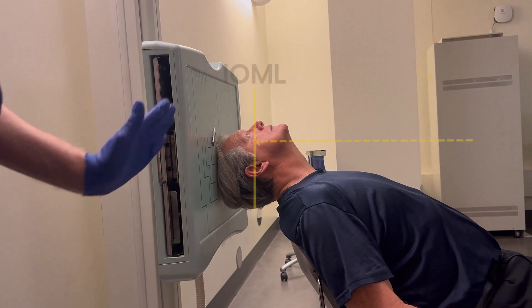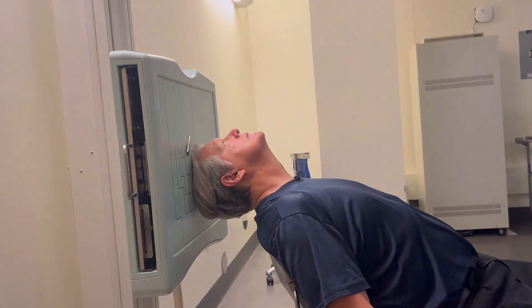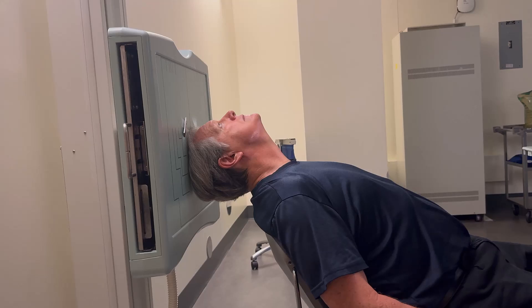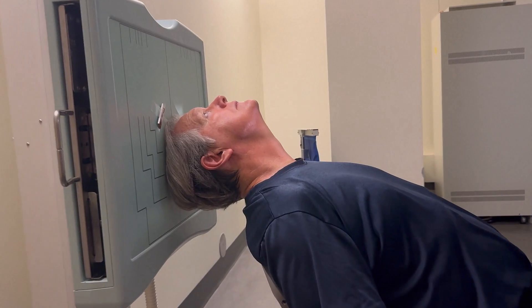We want the IOML coming out of the floor, but it's a lot easier if you just think: I need to line up the chin and the forehead. You're going to see some light on the sides. It's okay to clip the soft tissue of the nose. Your centering is, I believe, three-quarters of an inch above the EAM.